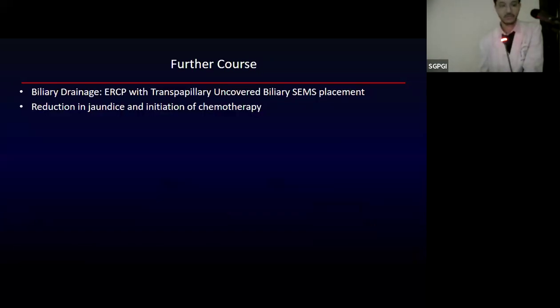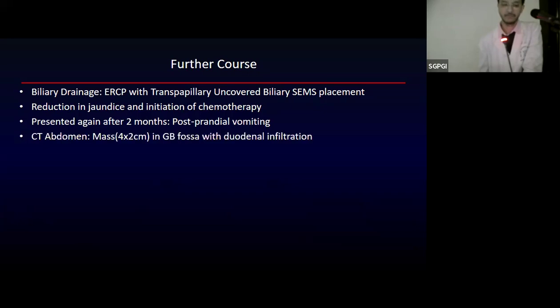So in the further course, the patient's biliary drainage was done using ERCP with transpapillary uncovered biliary SEMS, which is self-expanding metal stent placement. It resulted in reduction in jaundice, and the patient was initiated on chemotherapy. However, the patient again presented 2 months later with postprandial vomiting.